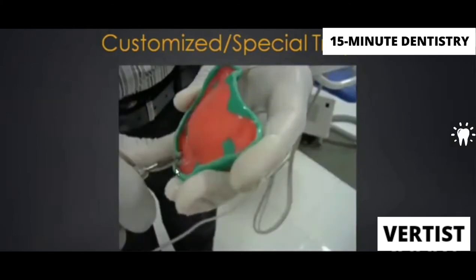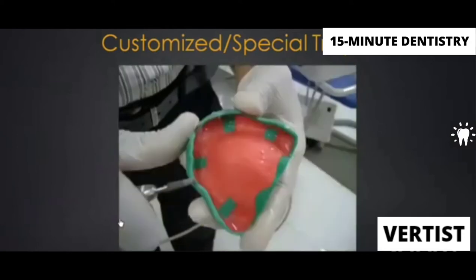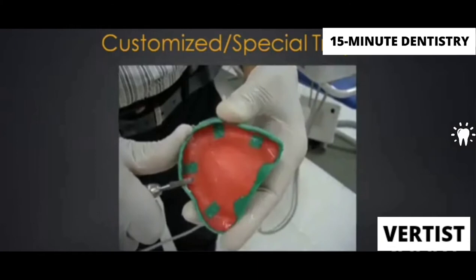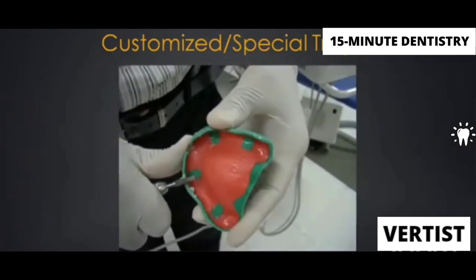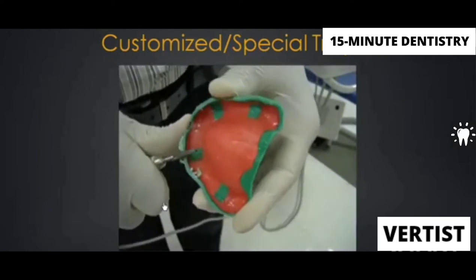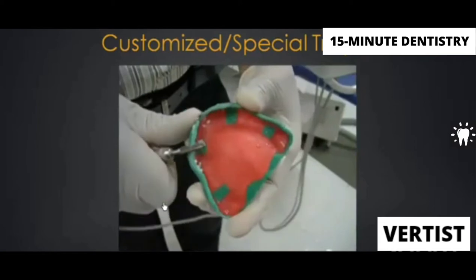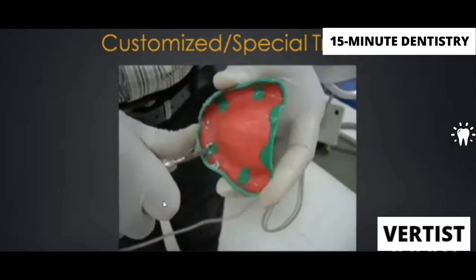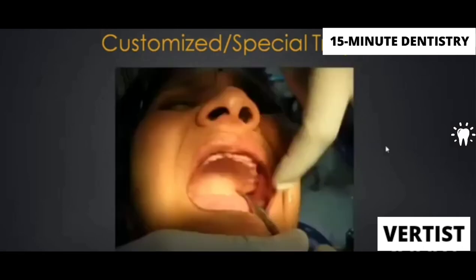Okay, so here you will see the notch made for the frenum. It is not made with a straight burr because that tends to make it very narrow. We are using a regular carbide burr which is slightly broader. After trimming, please ensure that the buccal and the inner borders are nicely rounded, as you can see in this video. Please ensure that. That is very important. Once you are happy with the borders all around, you have to check whether posteriorly it is extending correctly at the posterior vibrating line. So the posterior part of your tray should stop at the posterior vibrating line.